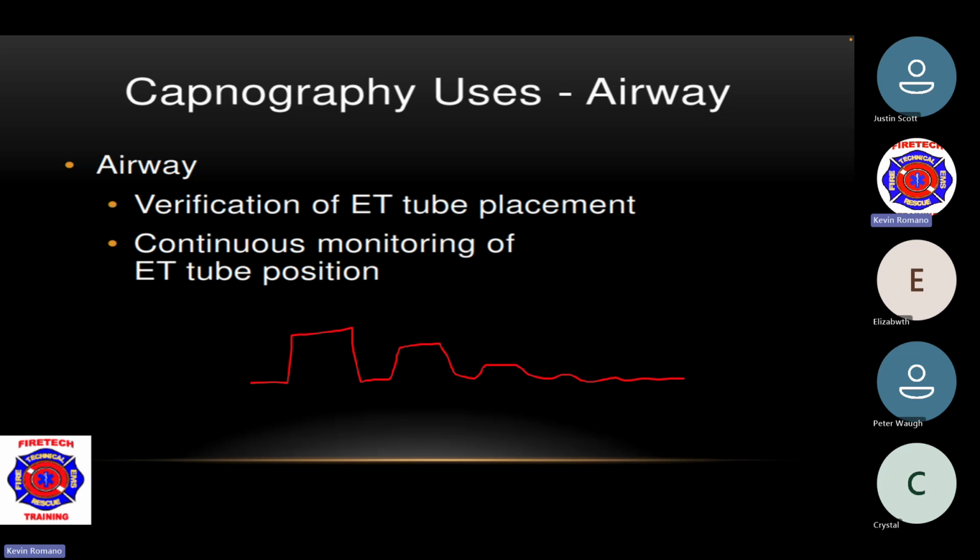So did the tube get dislodged around this point here, and we lost that intubation, right? So we start seeing that we don't see any more movement. That could be the fact that the ET tube was just now displaced.